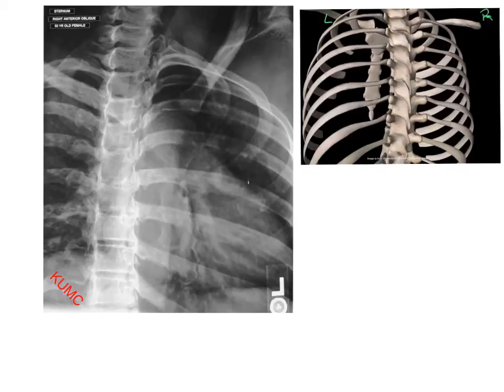We are going to evaluate the RAO sternum projection today. I'm not going to go over the lateral because I think it's a fairly uncomplicated projection to view. There's very little anatomy, and there's just not as many questions. The RAO sternum is a right anterior oblique position of the patient.